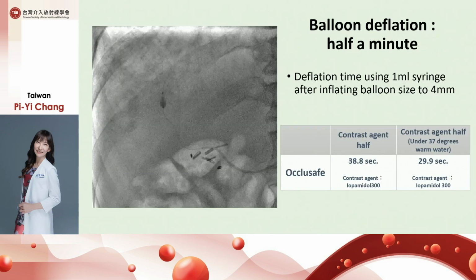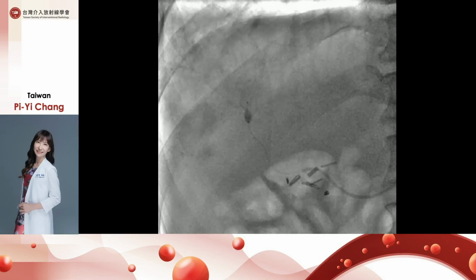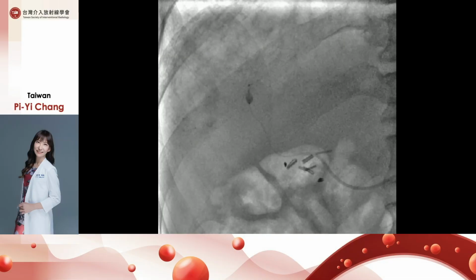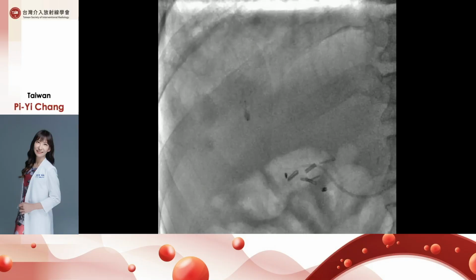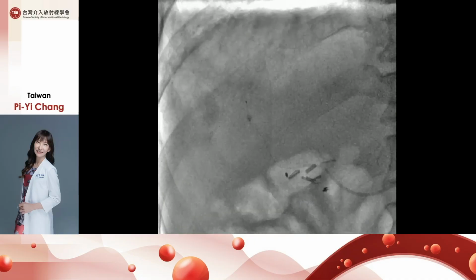Yes, so balloon deflation is around half a minute. So don't be rushed. You have to see the balloon deflated under the fluoroscopy, and you have to wait around 30 seconds. So you have to be patient. Then after all the contrast medium is gone, you can remove your microcatheter. Yes, you have to wait, okay?